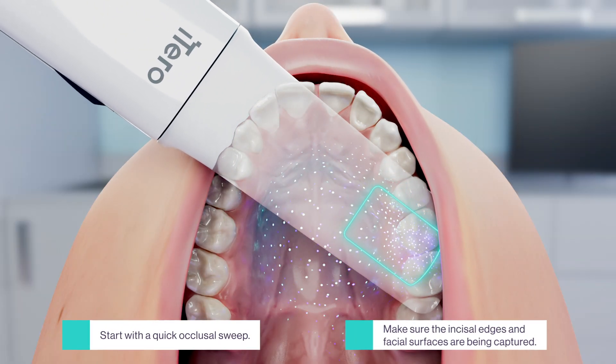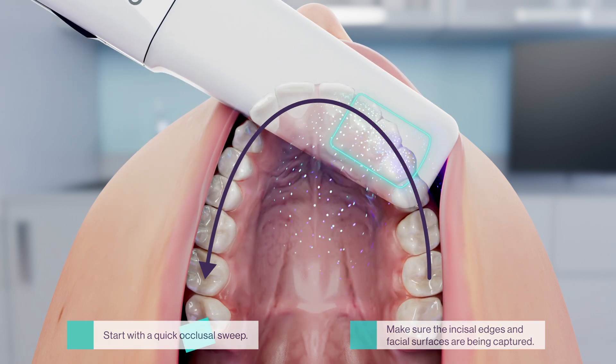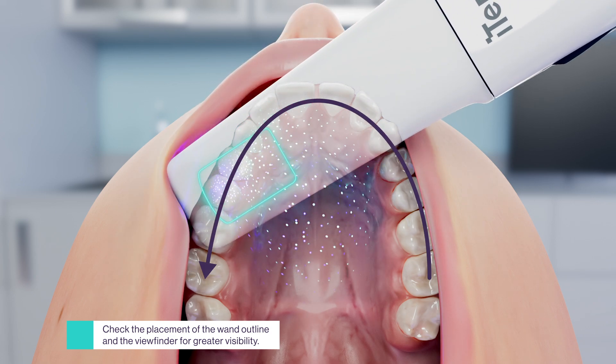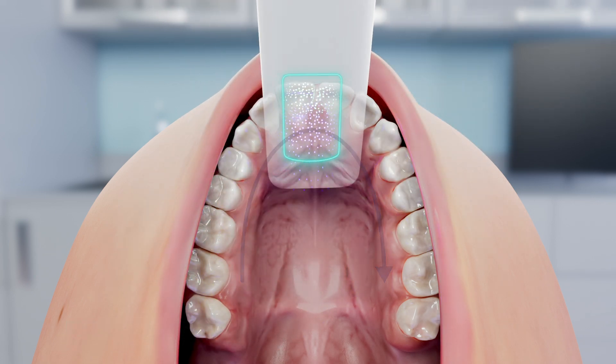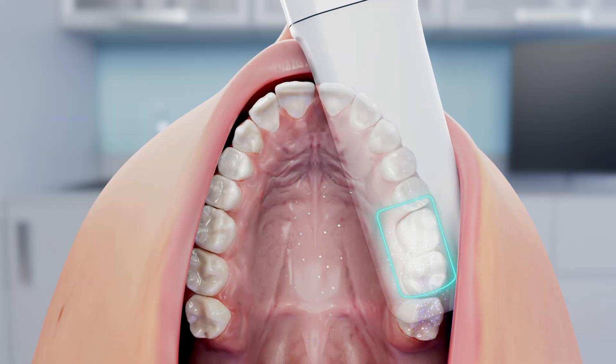Continue to the upper jaw, repeating the same sequence. Retract the lip in a V-shape and move the wand to capture lingual, incisal, and labial anatomy of the anterior teeth. Roll lingual to fill in missing anatomy. Hover over the occlusal and position the wand posteriorly.